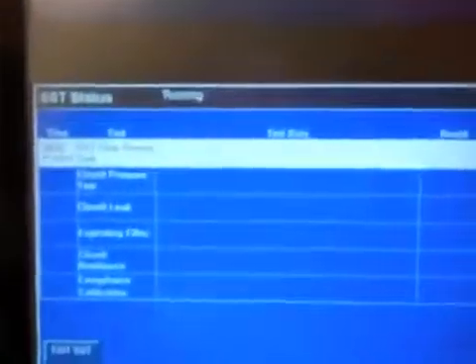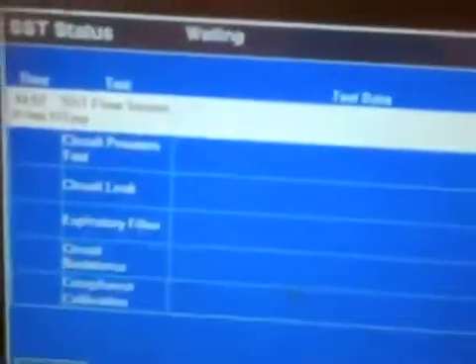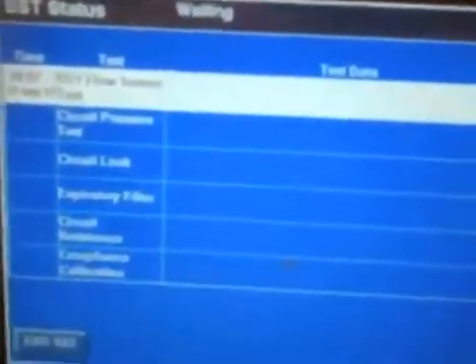This is the screen that we'll be running our SST in. So you can see we're going to do our flow sensor, our circuit pressure, circuit leak, expiratory filter, circuit resistance, and compliance. Down in this bottom right corner, this is where we're going to get our prompts.